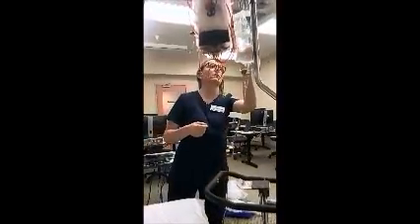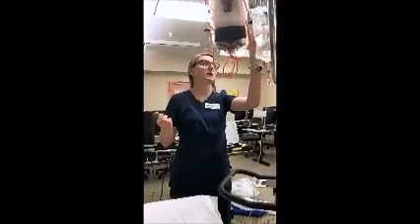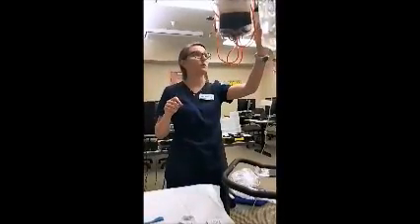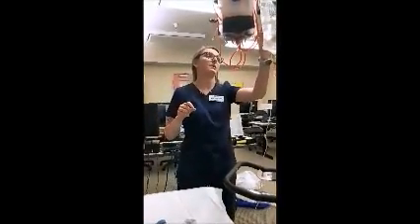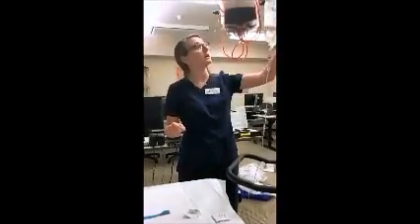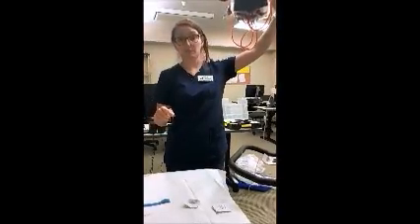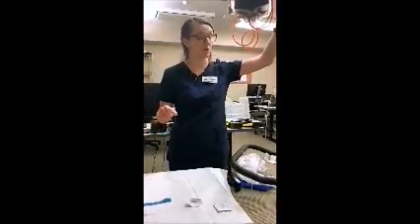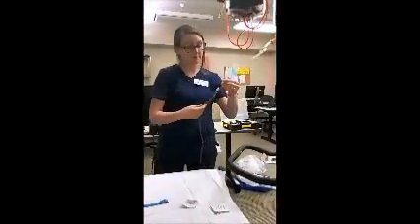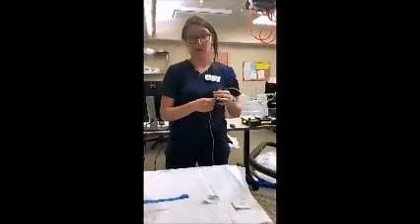So we'll look on the back of the bag and verify the patient's name and birthday, initials and birthday, the start date and time, and the discard date and time. So that would be 4/4 at 1:30, and 4/4 at 9:30 would be when we were stopping it. The nurse's initials who started it, as well as the time that she started it at. And we'll check on our time strip here and see that it's been down about 125 milliliters in the last hour, so that means that that flow rate is going well. And then we'll kind of just move our way down here. We're going to look at the tubing and make sure that the tubing's not discolored, cracked, or has any air bubbles in there. We don't want to see any air bubbles.